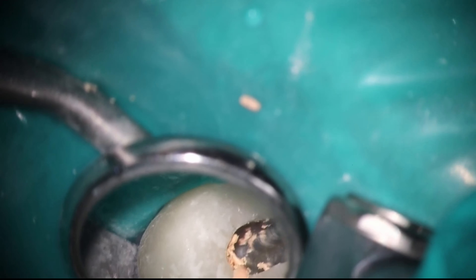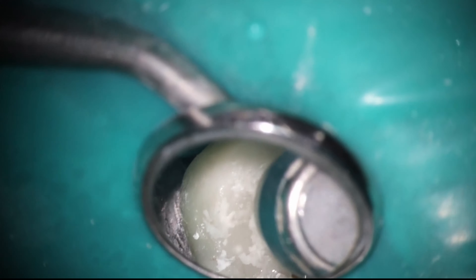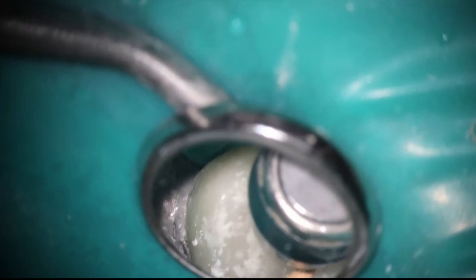Now you'll see I do struggle a little bit with the MB2. If you saw in the cone beam, it takes almost a right angle into the MB1. What I'm doing is just trying to remove as much as possible. I don't think I'm actually going to get patency in there, but as it's very clear that it does join, we're going to run the GentleWave — it's going to clean out everything. I don't want to trough away a huge amount of tooth structure because that's just going to predispose the tooth to a fracture. I'm not taking these all the way to length because I'm hitting the dentinal plug.